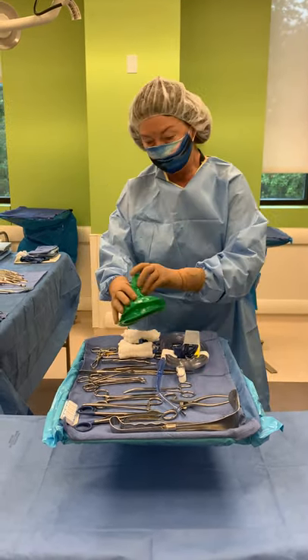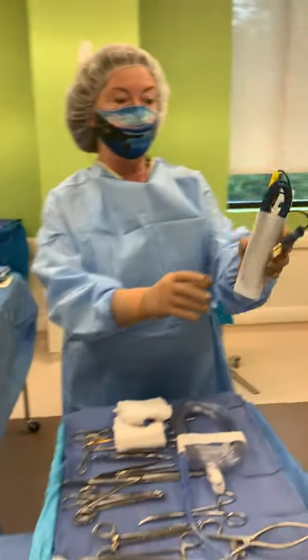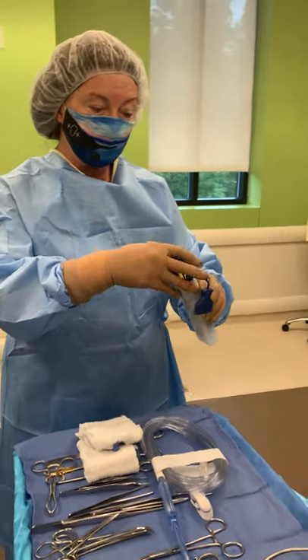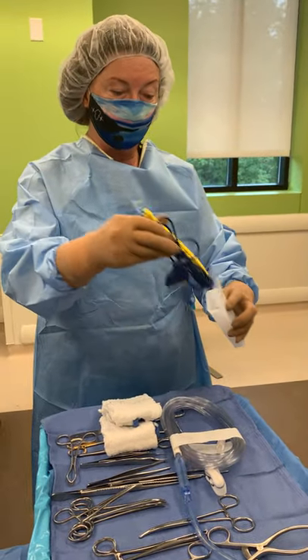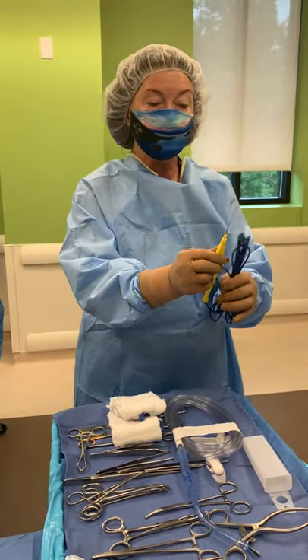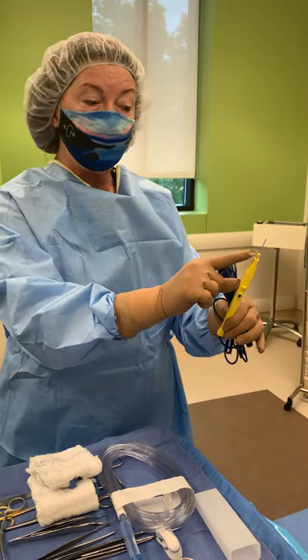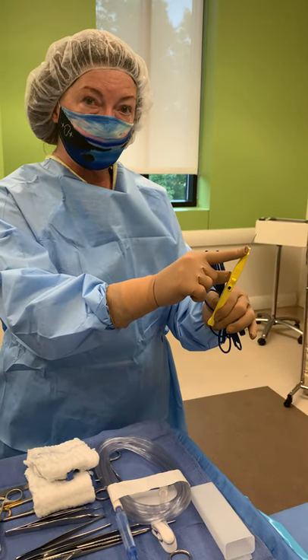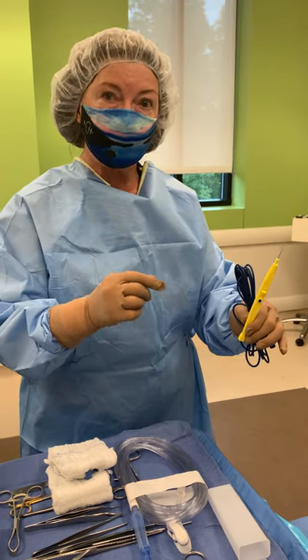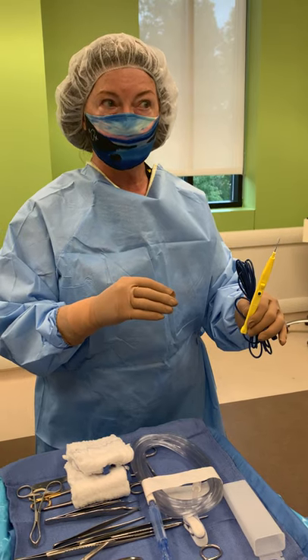Notice that this is how the bovie comes — it comes already in its holster. I completely take it out of the holster. Now this is the point at which you will need to know in your case whether you keep this regular tip that it comes with, or whether we need to exchange it for a teflon tip, if that's on the surgeon's preference card.